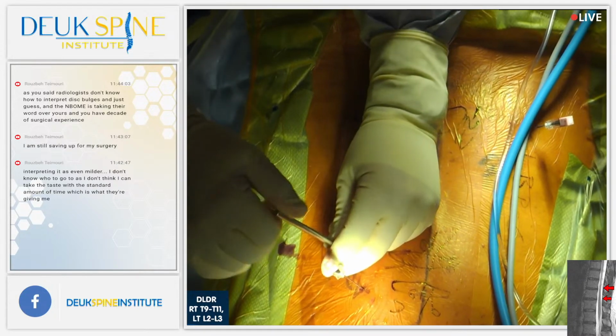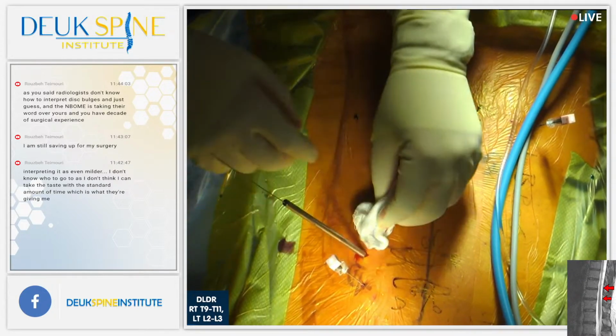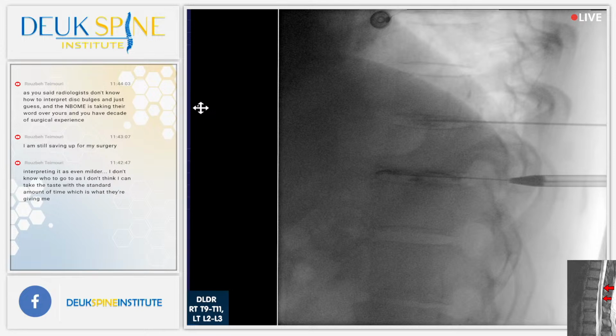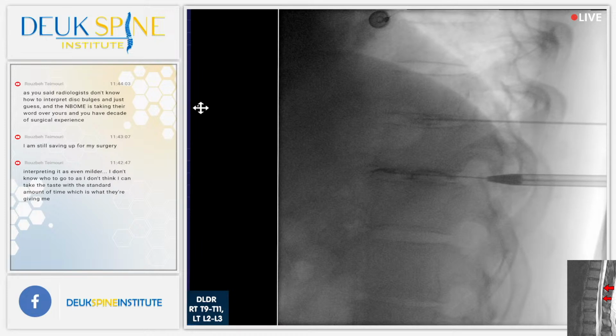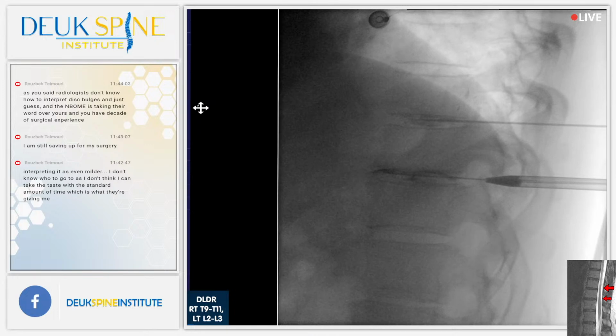And it's not something that's unique to me. All good surgeons are that way. I was taught that in residency. You need to be able to not just use your eyes, you have to use your fingers. Okay? And that's why when you do robotic surgery, the robot gives you feedback, resistance feedback to the tissues that the robot's feeling. That makes any sense?